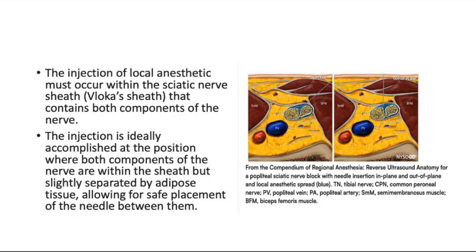So if you can get it within the epineural sheath, then the injectate should remain within the fascial compartment. Even proximal to that, the nerve would still be within the intermuscular fascial compartment, and therefore the onset should be correct. The main issue is the identification of the nerve.